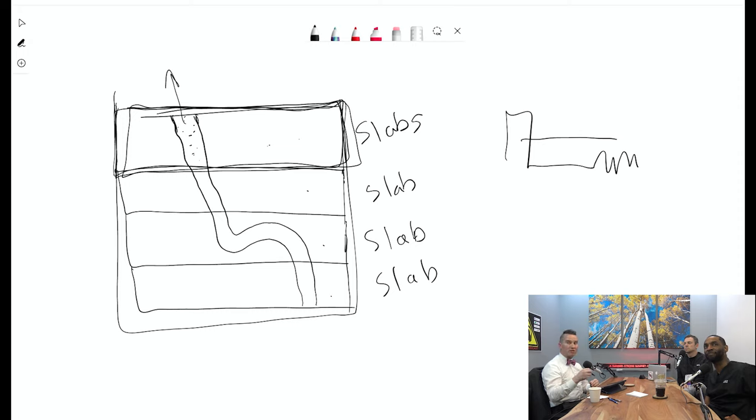We're giving it time for new protons to come in and old protons to be leaving. But the idea here is that we want to keep these really bright and fresh, and we want to keep this background nice and dark. Okay, so all we're doing in this case is one slab at a time.